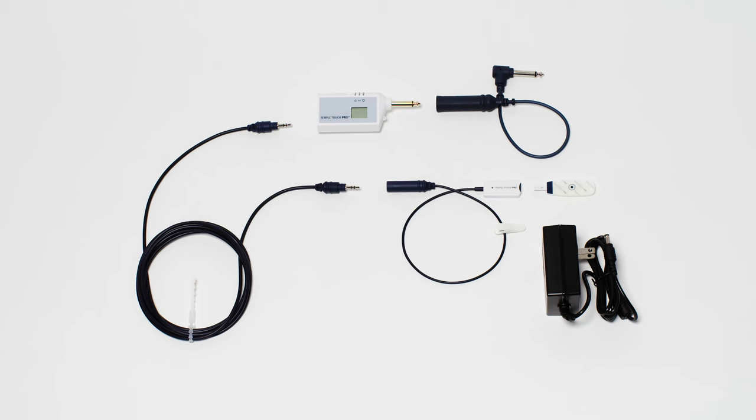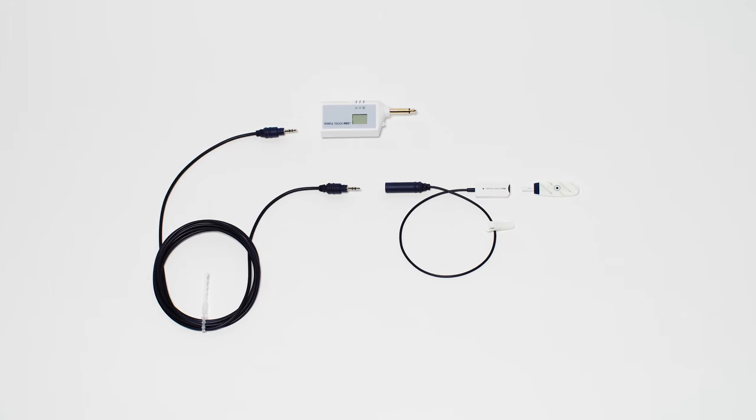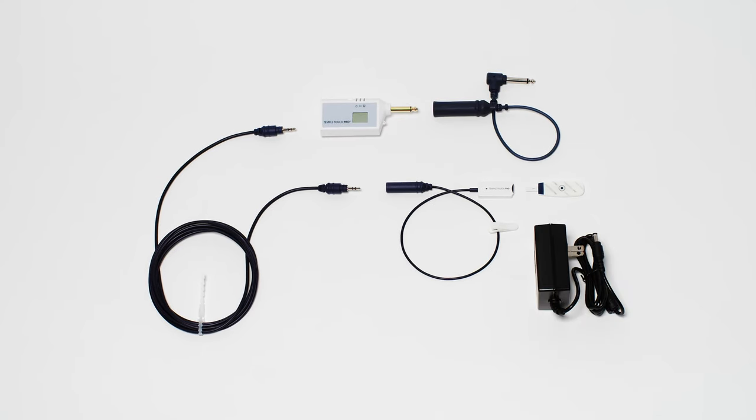The Temple Touch Pro system contains the following components: a sensor, connecting cable, monitor connecting unit — also known as an MCU — optional interface cable, and power supply.